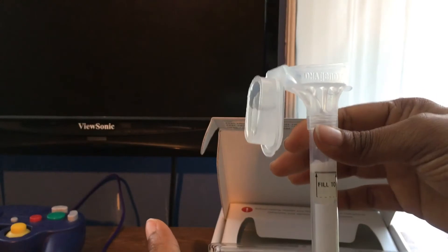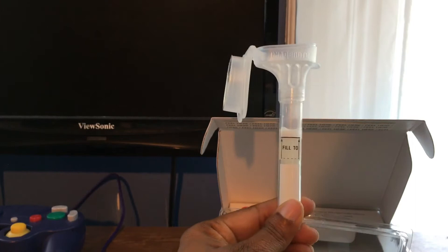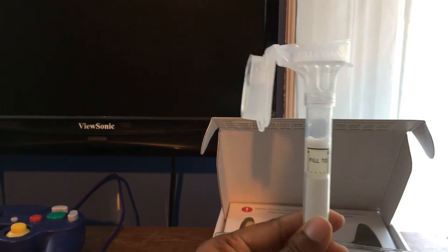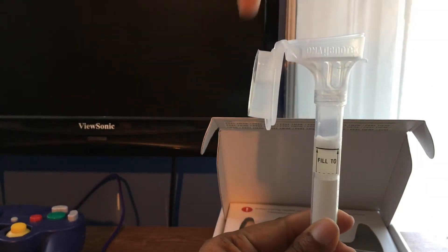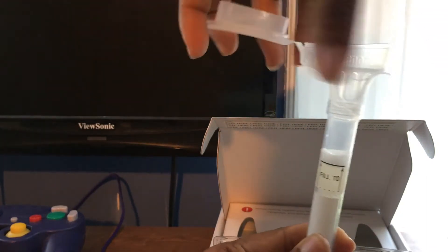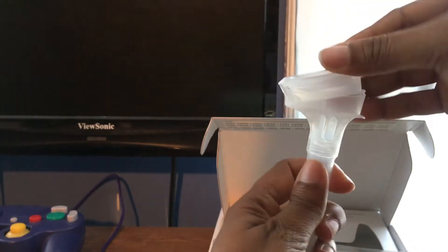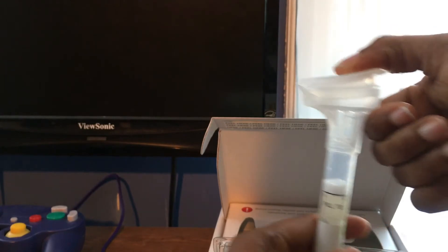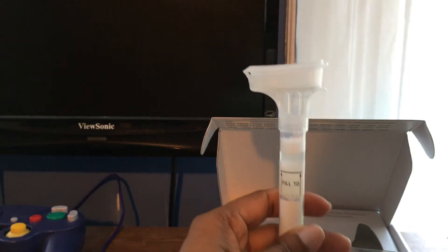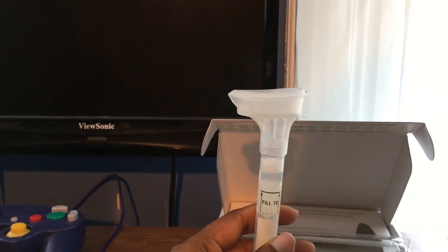I was finally able to fill the tube — it's a bit dark, I apologize. It wasn't that easy generating enough saliva, but I got it up to the line. Now you close the lid like this — there's liquid on top — so as you press it down you'll hear the click. All right, good.